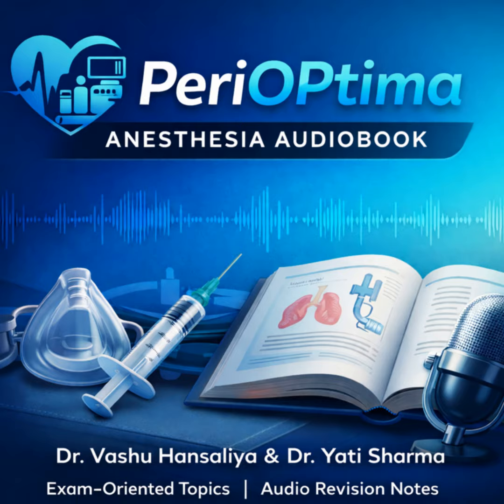And at the other end, the proximal end. That's the control section. This is the unit near the eyepiece where you, the operator, interface with it. It's got the eyepiece, a diopter ring for focusing, and most critically, the control lever. The steering wheel. The steering wheel, exactly. It lets you manipulate the distal tip's angle up and down, flexion and extension, via those internal angulation wires. If those are damaged, the scope's useless.